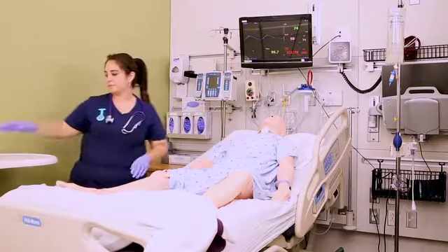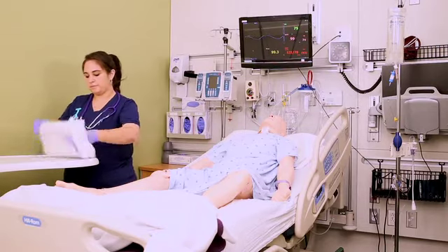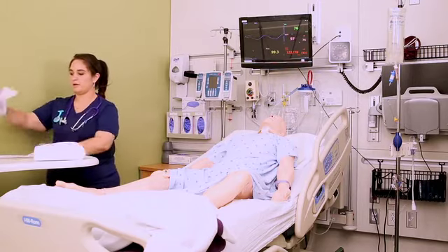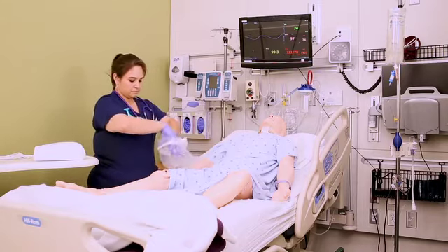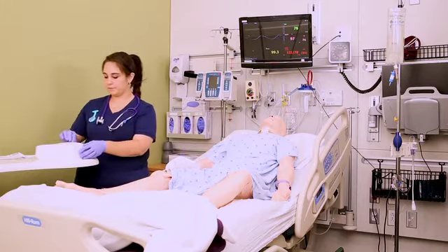Open the Foley kit and remove it from its plastic bag. These plastic bags are really nice because you can fold the top of the bag over and make yourself a little trash bag. Place it next to the patient's hip close to you so you have a place to throw trash without contaminating your sterile field. Then open the sterile kit on the bedside table away from you.